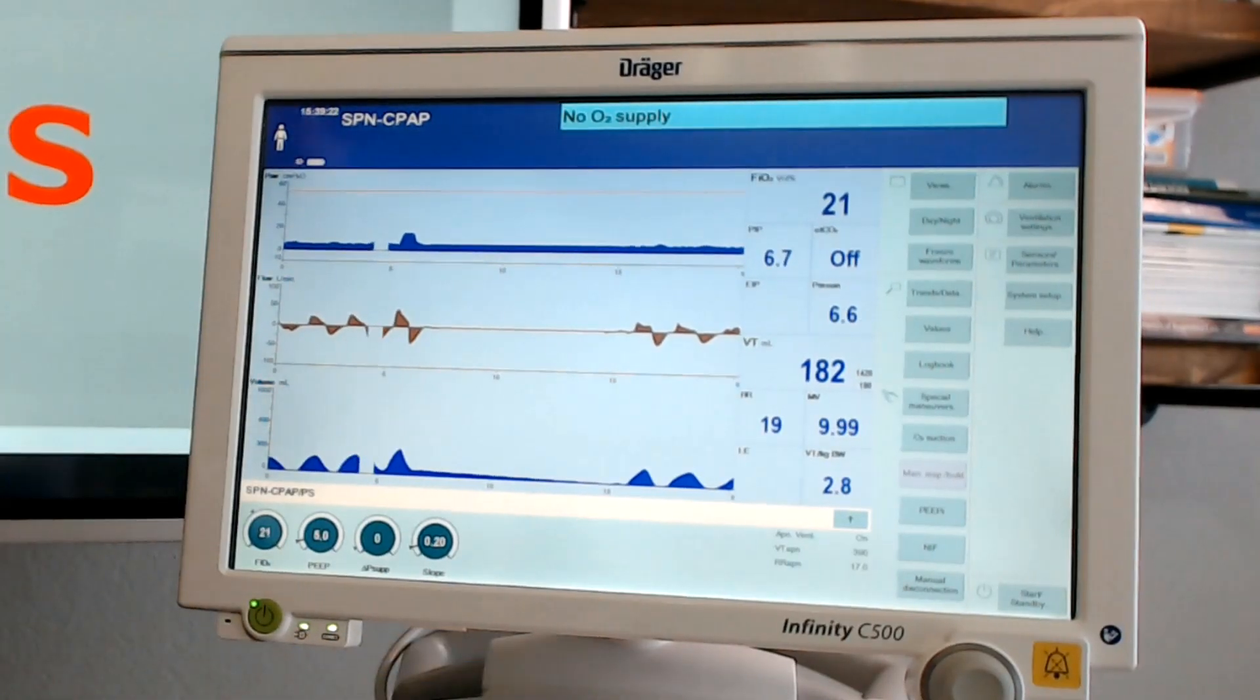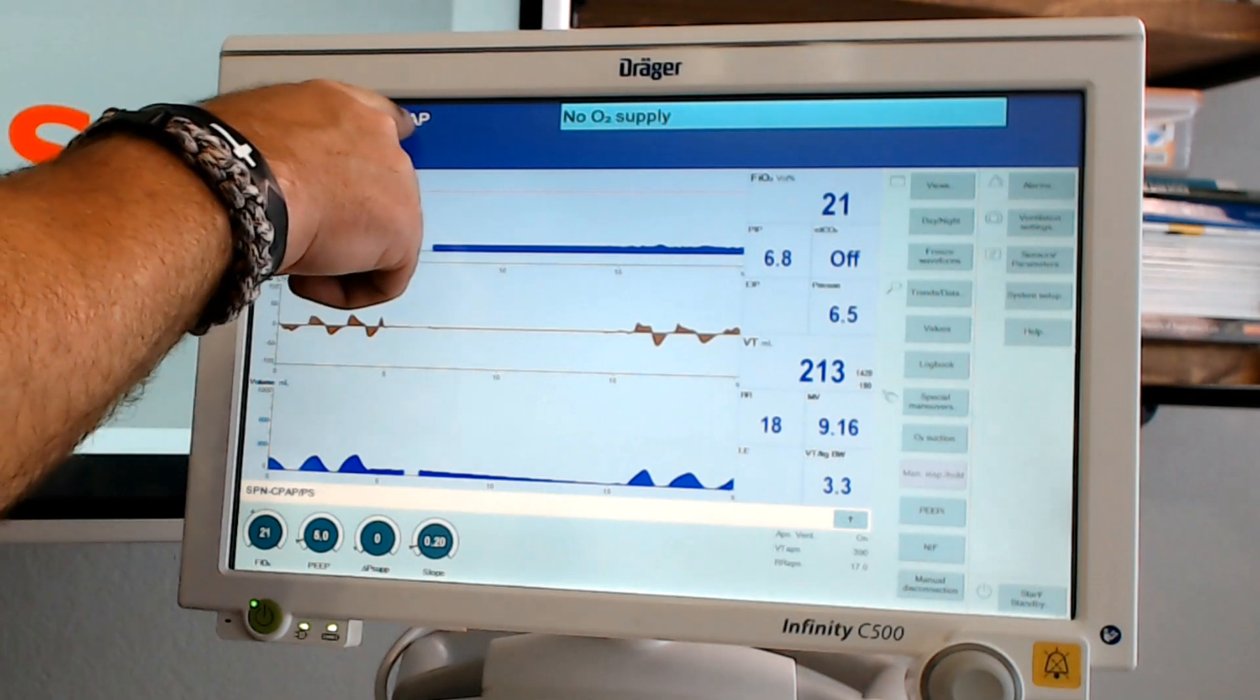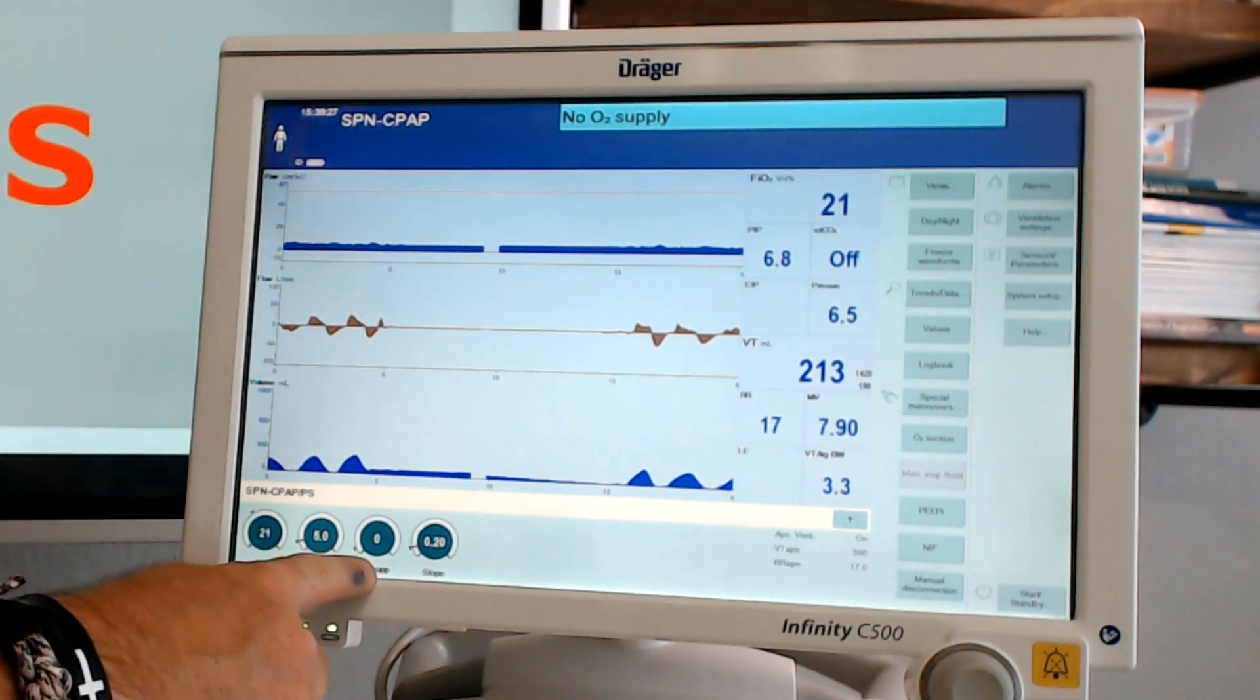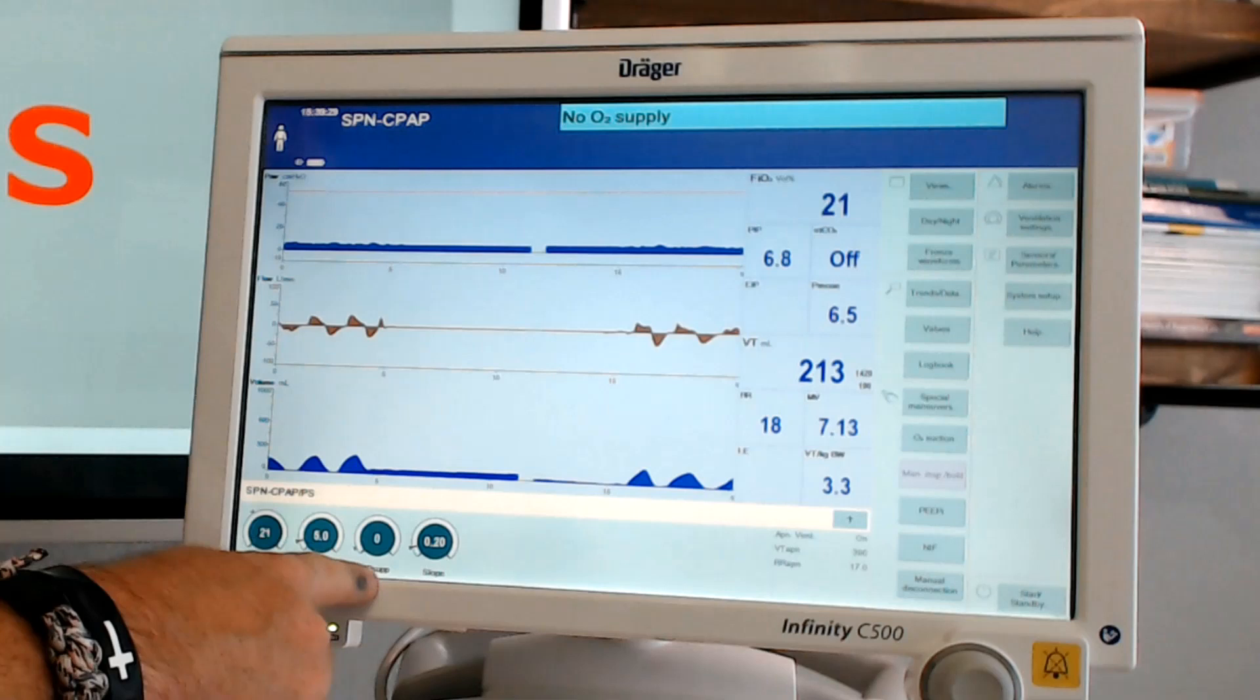What we see here is that we are now in spontaneous mode. We're in CPAP. We also have no pressure support dialed in. We have a PEEP of five, but no pressure support dialed in.